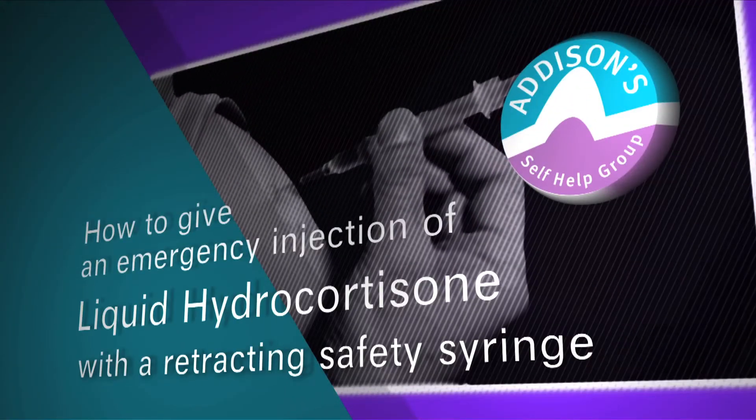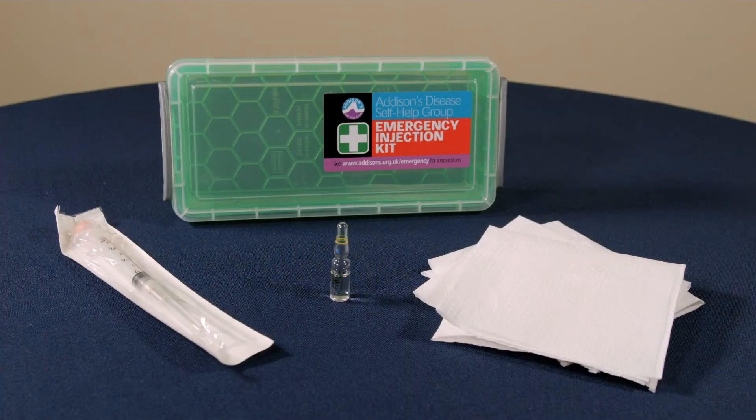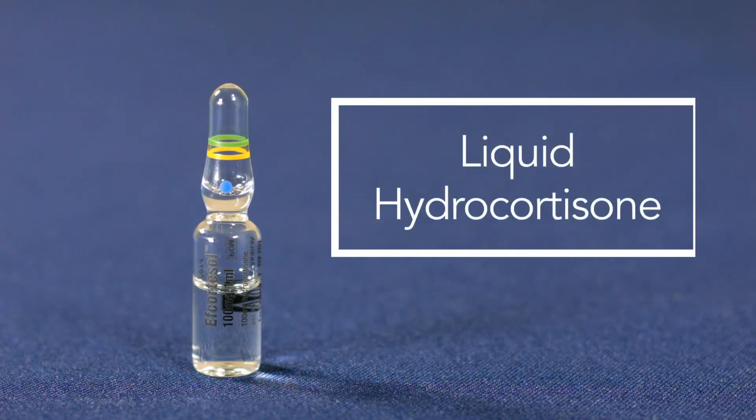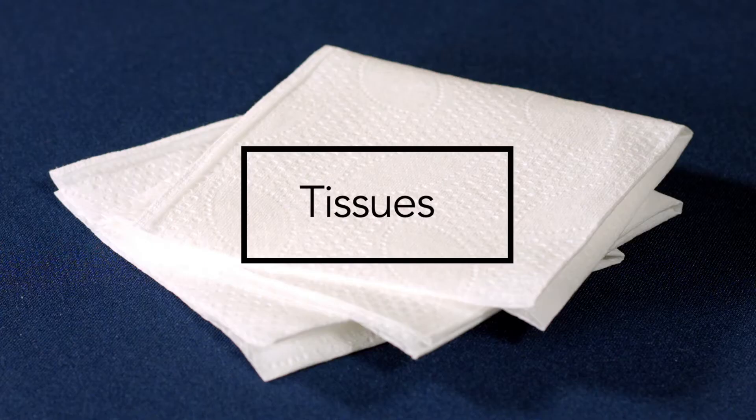This video explains how to give an emergency injection of liquid hydrocortisone using a safety syringe. You will need a glass ampoule of liquid hydrocortisone containing 100 milligrams of hydrocortisone sodium phosphate, a safety syringe, and some tissues.